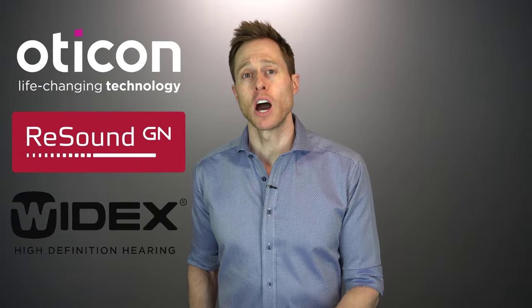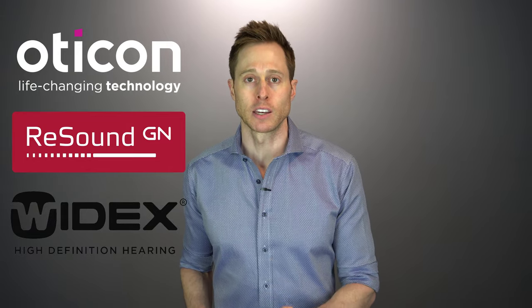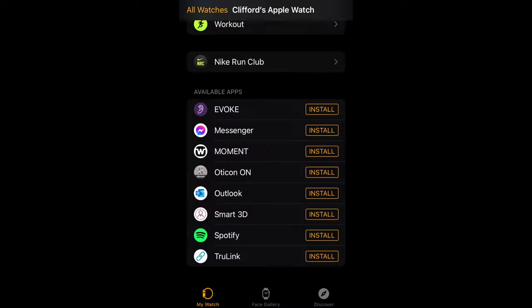Now let's take a look at some of the hearing aid brands that allow you to use your iWatch. There are three brands that are compatible with the iWatch: Oticon, Resound, and Widex. It is important to note that the hearing aids manufactured by these brands have made for iPhone hearing aid technology. And while all three of these brands do also allow you to connect your devices to an Android device, you cannot use an Android device with your iWatch if you want access to the app controls. In order to get your iWatch to work with your Oticon, Resound, or Widex hearing aids, you first have to download the hearing aid app from the App Store onto your iPhone, and then go to the watch app on your phone and install each app from your iPhone onto the watch. Once you do this, you will see that the hearing aid app that was on your iPhone is now also on your iWatch.